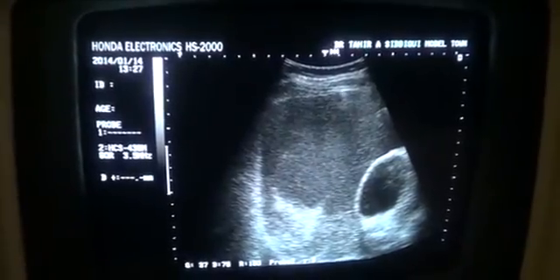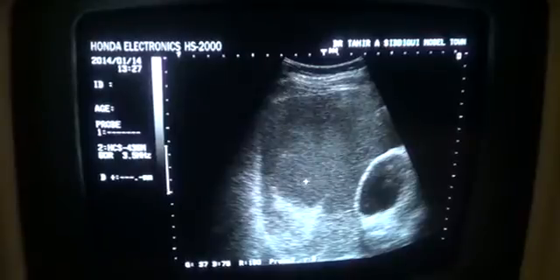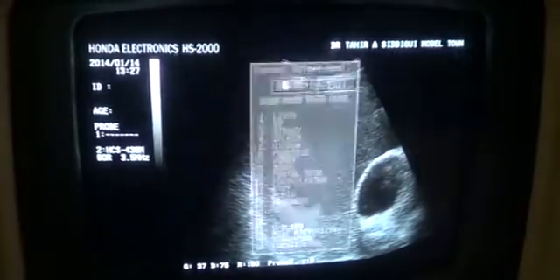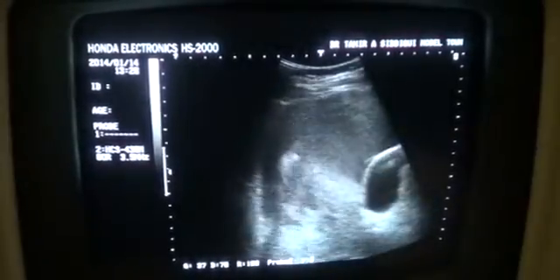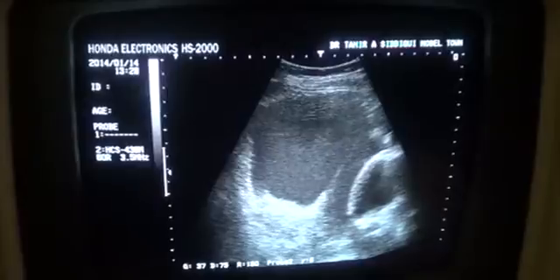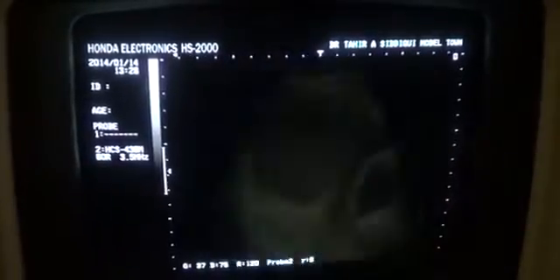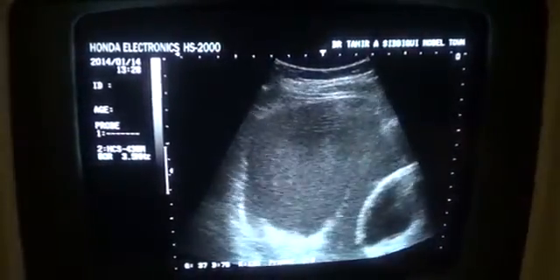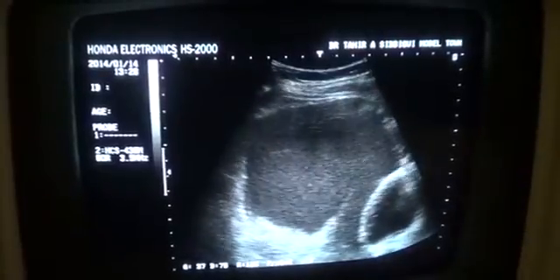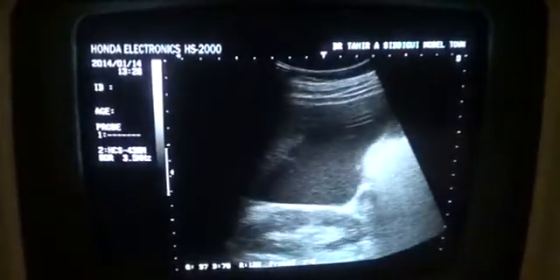This is the gallbladder, and the fluid is filled with low-level floating echoes. You can see the movement within this fluid. The right kidney is normal.